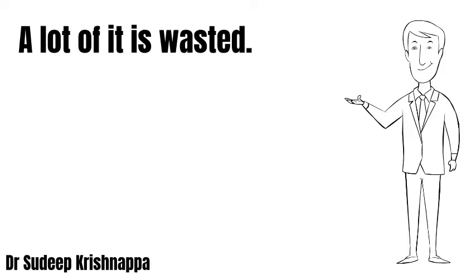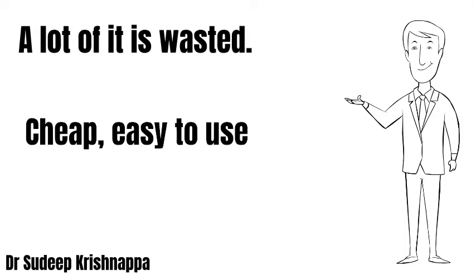That nearly accounts for about 50% of the wastage. But why do we still continue using these devices? It's mainly because they are quite cheap and easy to use.